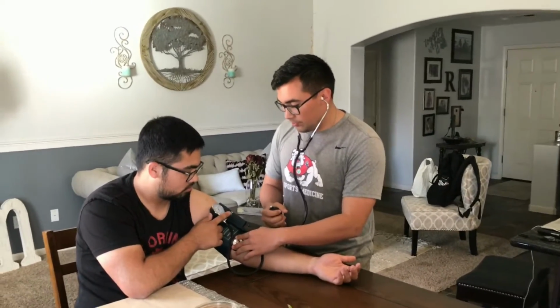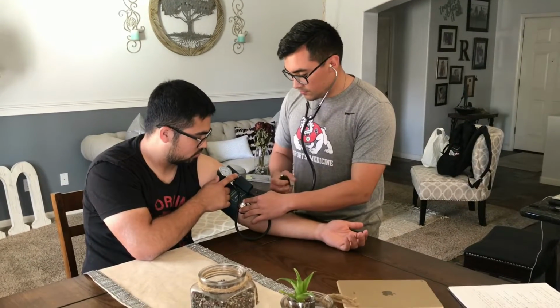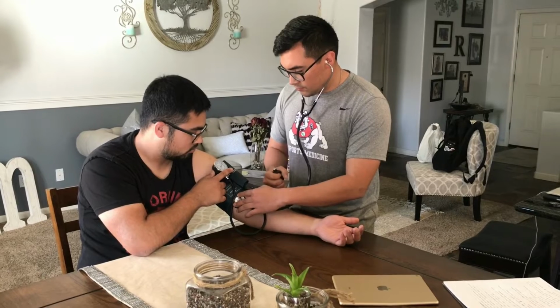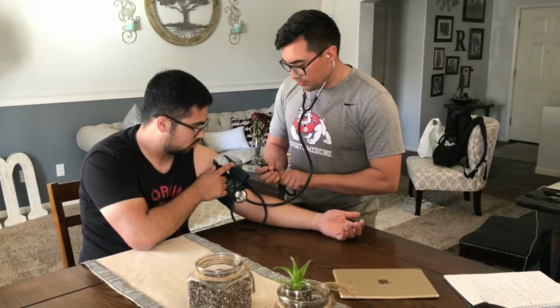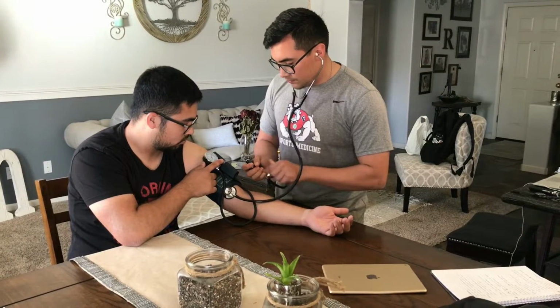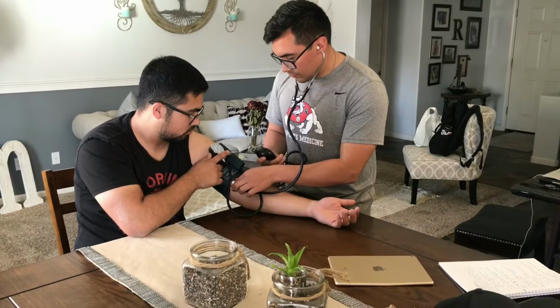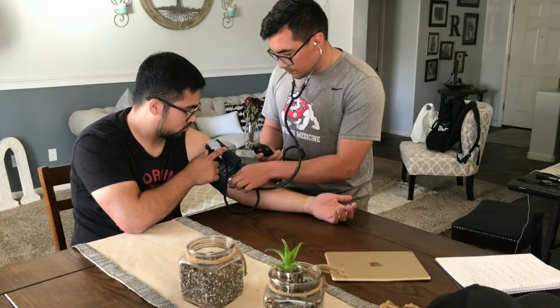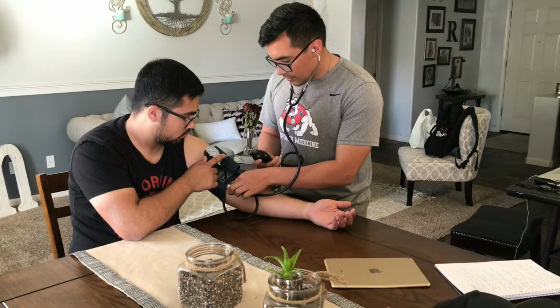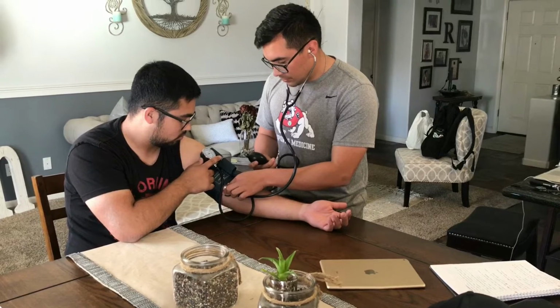So let's pump it all the way up to 200. And then I want to release at a rate of about 2 millimeters of mercury per second. Then I'm looking for that first noise. Then I'm looking for the last noise when it disappears. That'll be his diastolic.